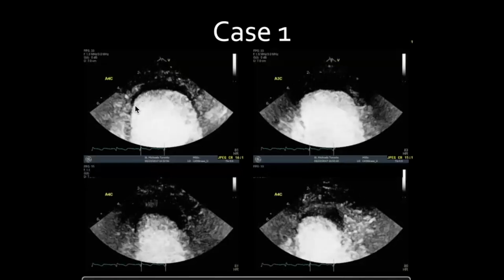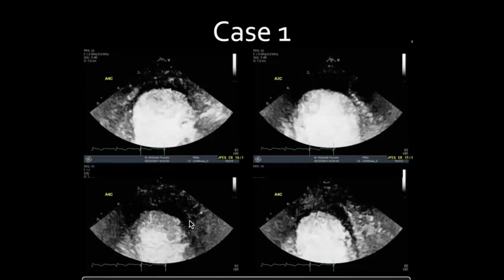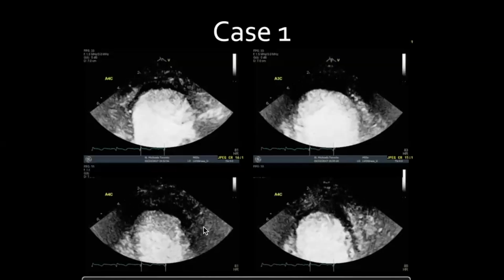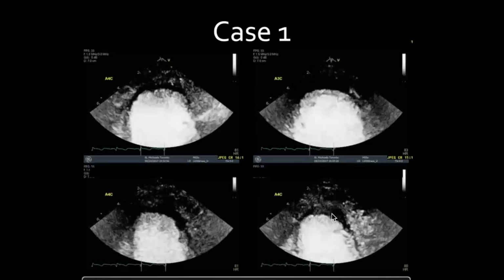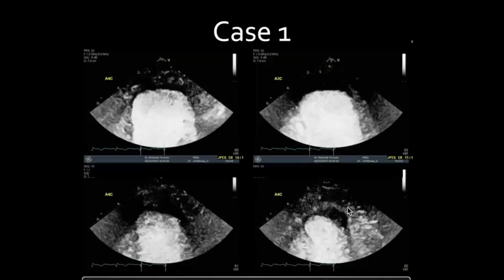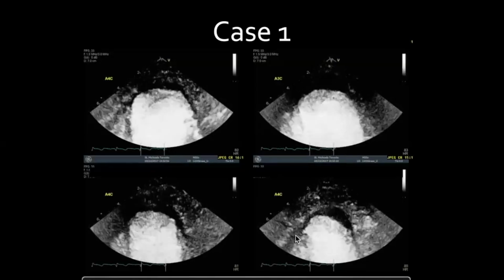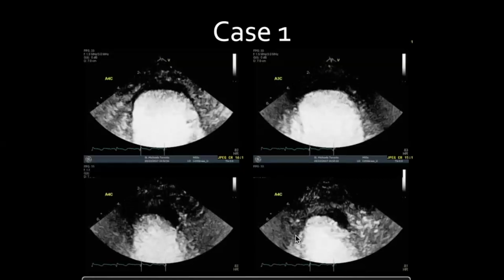It's quite broad, actually. You can see it here in the 4-chamber and 3-chamber views. You also want to angle a little bit here, as we're angling in the 4-chamber view. Here you can see it's a little bit thicker on the apical lateral aspect. How do you differentiate this from myocardium?